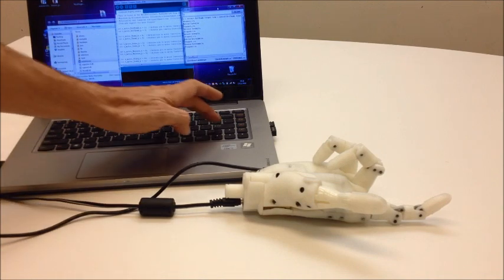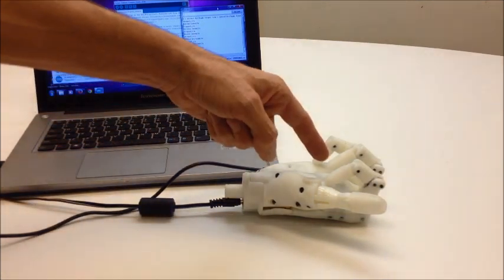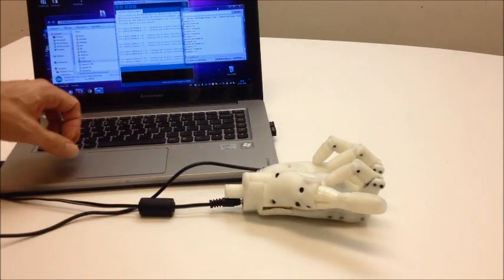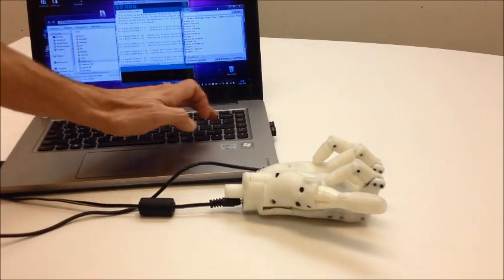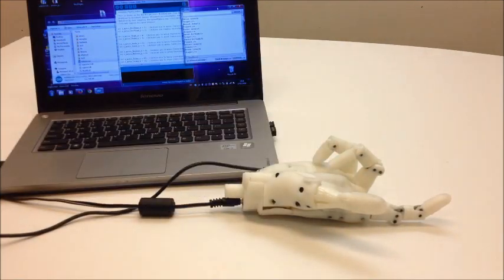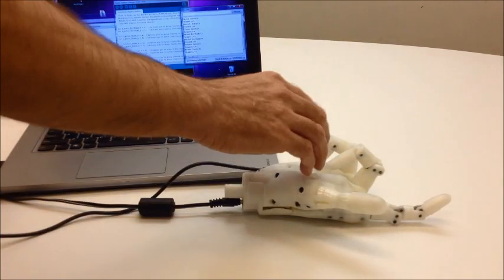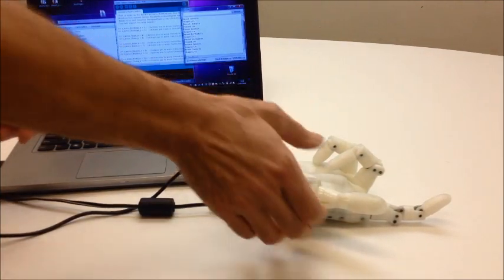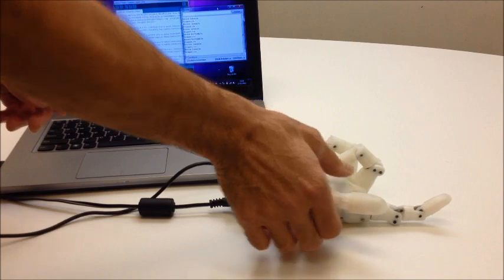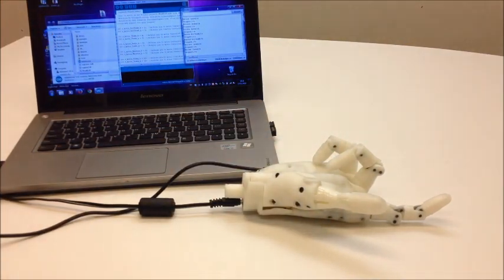And then if I do again the index, you can see it's closing, opening, the speed is pretty good. And the torque is not bad either.